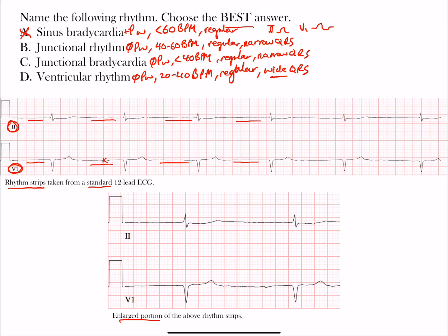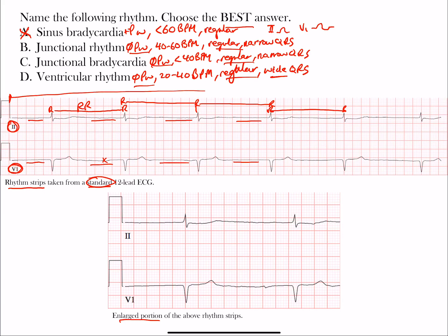So answer choices B, C, and D all have no P waves, meaning rate and QRS width will help differentiate them. We have a regular rhythm — the R-to-R intervals are all the same. Now let's find the rate. On a standard ECG, the strip from beginning to end is 10 seconds; 10 seconds times 6 equals 60 seconds, which is one minute. So we count the number of QRS complexes and multiply by 6 to get an estimate in beats per minute.